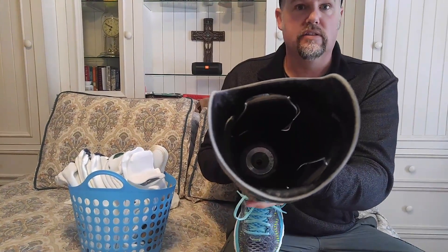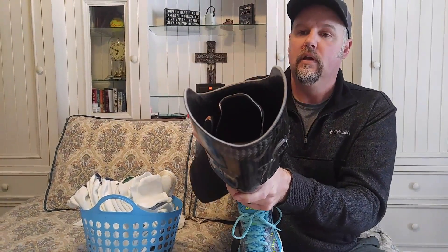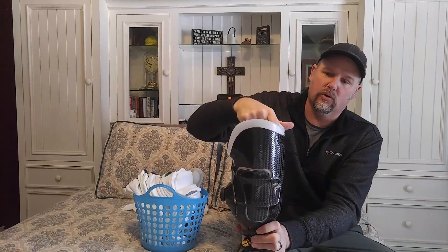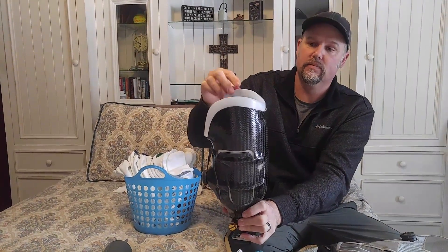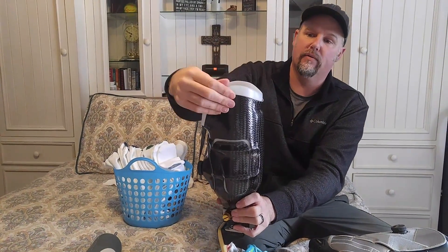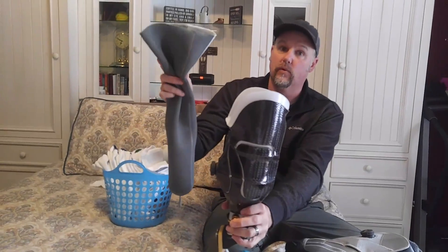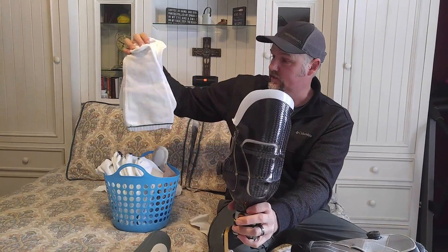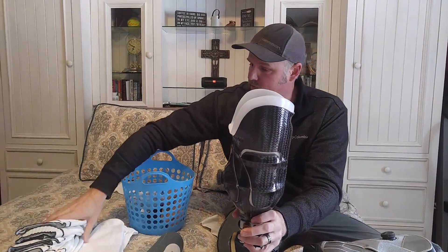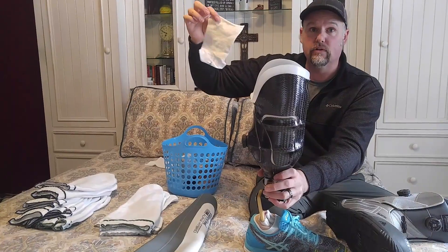If you look inside, this is a standard pin lock system — there's the pin, standard liner. Nothing's really different about this system. The way Renee uses it is with a flexible inner liner, which gives you a little more comfort, especially up around the higher edges, so the carbon fiber isn't digging in. In her case, if she gets into this socket in the morning, she puts her liner on and probably wouldn't be wearing any socks at all. Mind you, Renee is not quite yet three months out from her amputation. These are her socks: five plies, three plies, two plies, and one-ply socks cut down to fill volume in different areas.